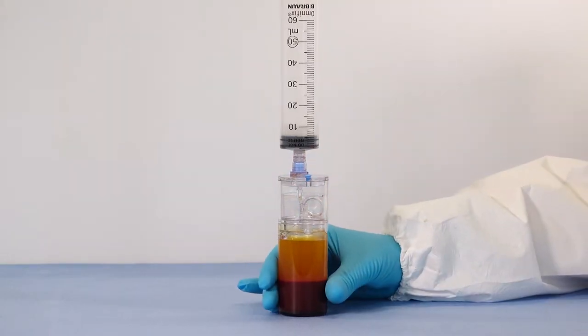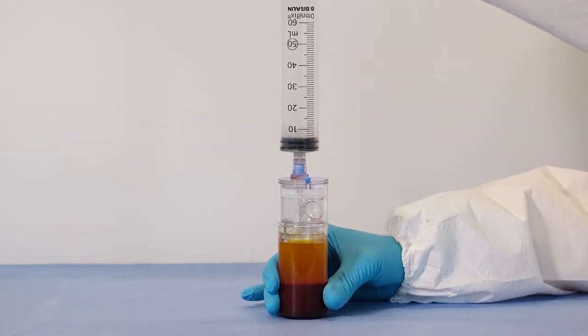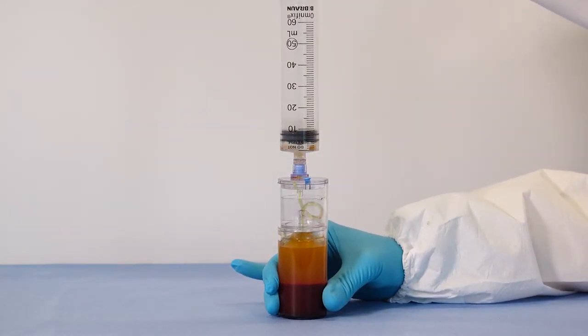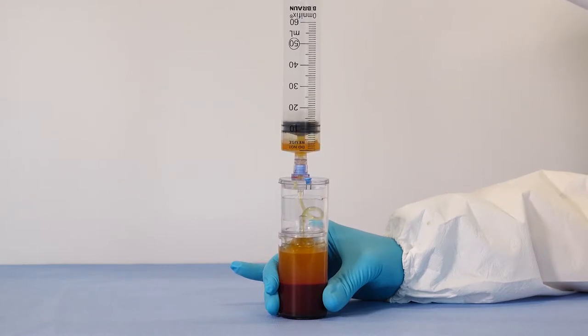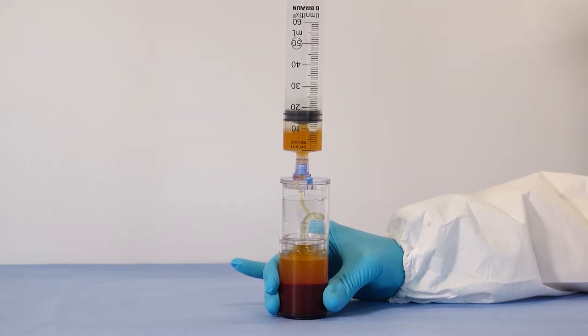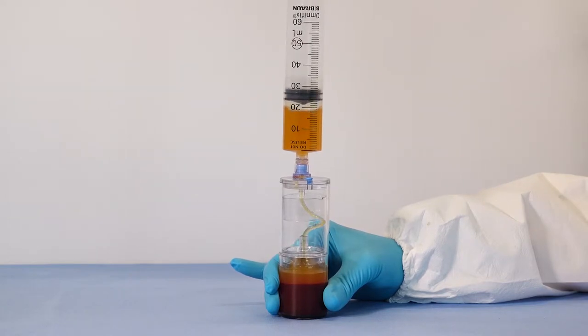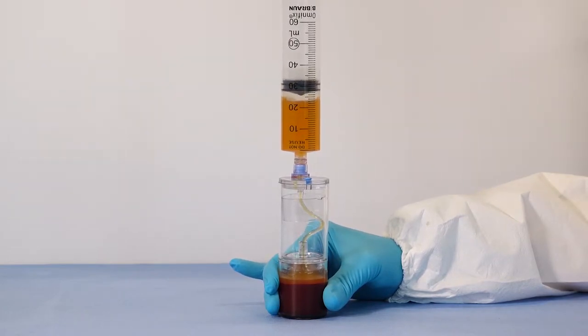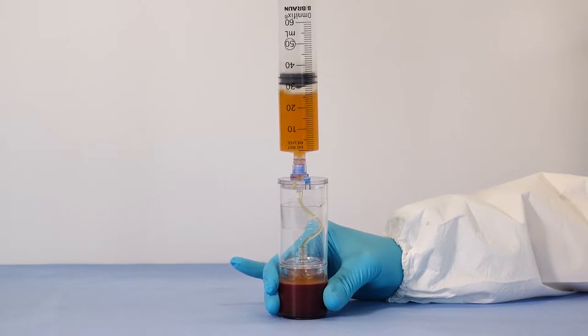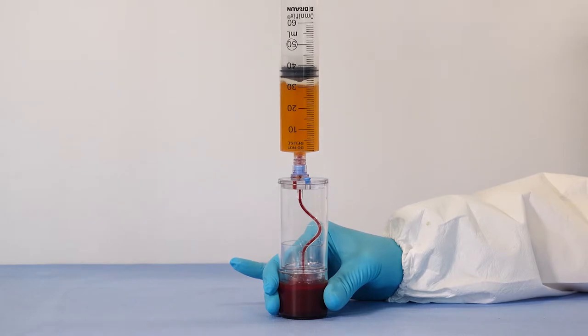Attach a sterile syringe to the top port and aspirate the Platelet Plasma Suspension. Aspirate until red blood cells fill the aspirating pipe.